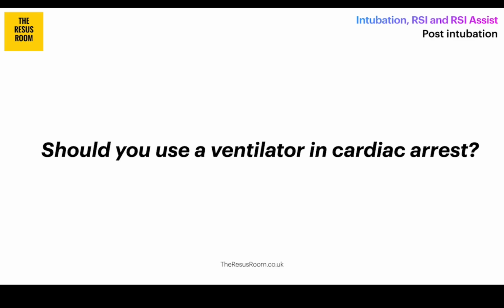I think the other time that I've used it, and this isn't regularly, and I think we don't know for sure how efficacious this is. And if you're going to do this, you need to do it very cautiously and with a lot of thought and a lot of attention to the monitoring of the ventilator parameters. But the situation that I have done this in is when you've got a post-ROSC patient and they've got a really well-seated advanced airway, probably a tube, although I would consider it with an iGel, but I'd be slightly more cautious. And those post-ROSC patients who then go on to have a subsequent rearrest.